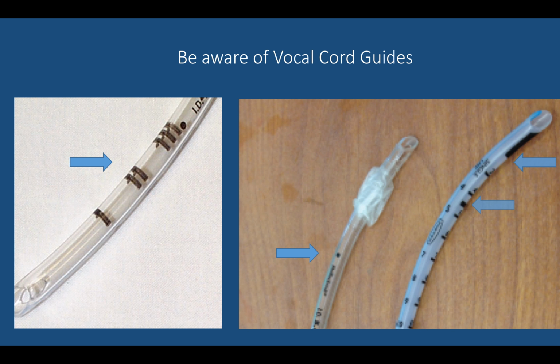On the right image, there is a dot on the cuff tube, and on the next tube, you can see a long dark black line and then a small one. All arrows are pointing at the particular marks. In the third image, you would want to aim for between the 2 black marks.